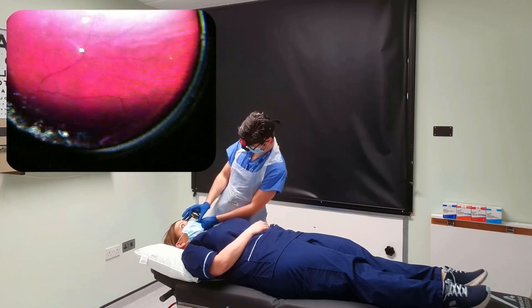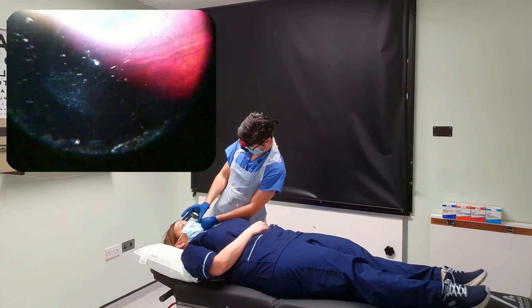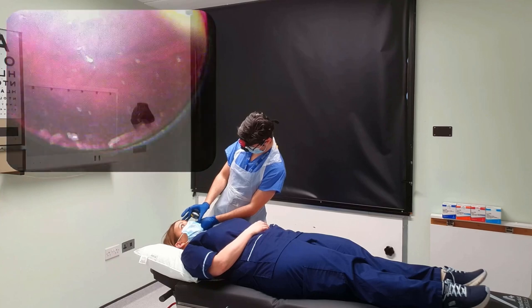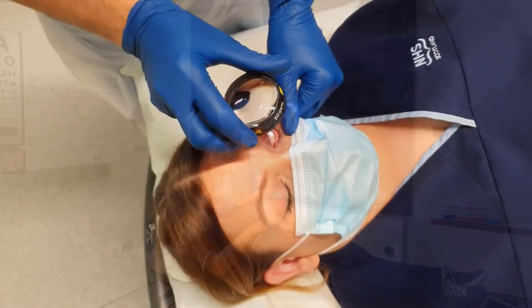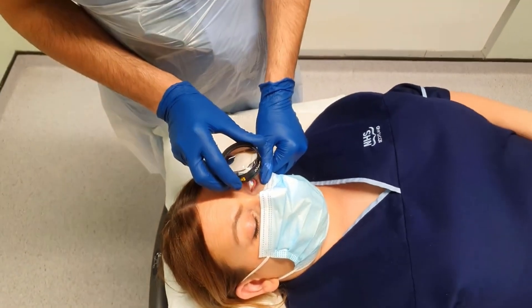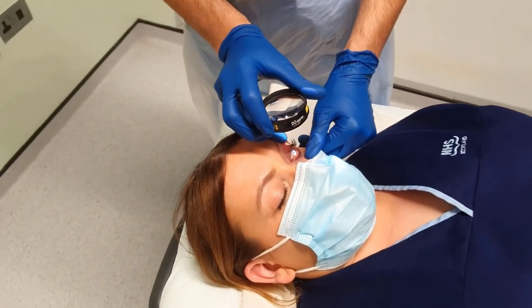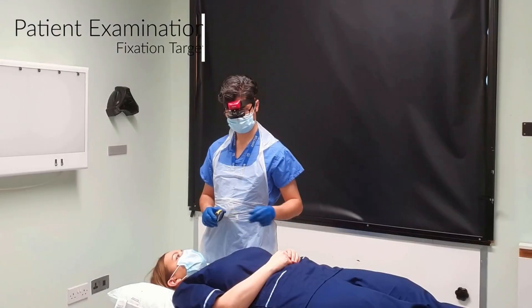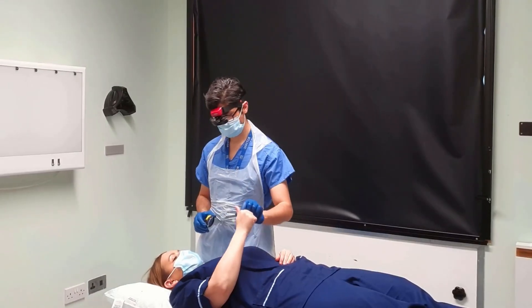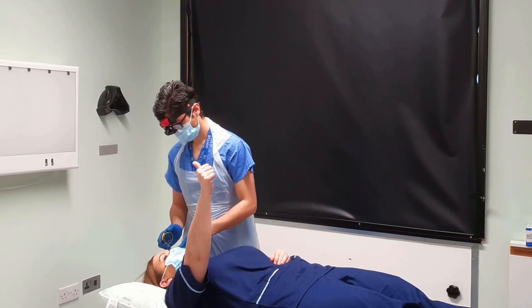You should examine all quadrants of the fundus. You should feel comfortable moving around the bed and tilting your body to help your view. You will likely need to keep the eyelid open to maintain your view with your fingers. If the patient struggles to maintain their direction of gaze, you can use a fixation target such as the patient's finger or thumb as shown here.